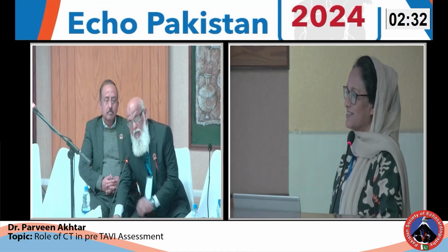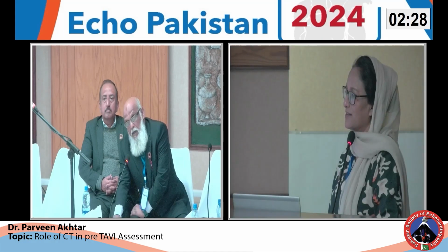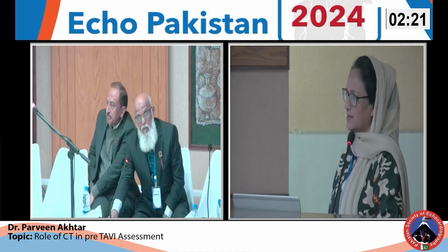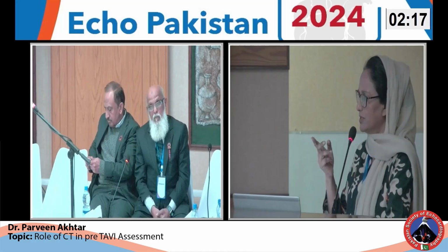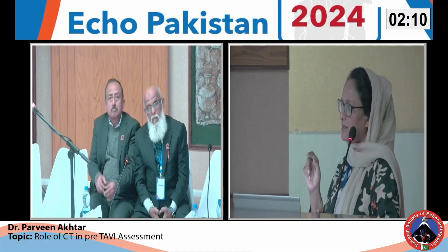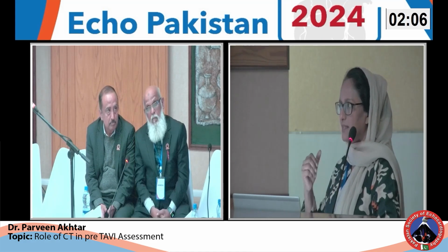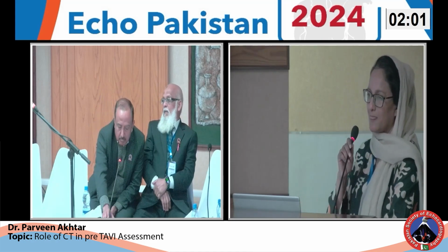No, I am not asking you that. I'm asking how often the interventional cardiologist refers you back after doing TAVI, for post-TAVI evaluation. As I told you, if there is a complication, like if they have suspicion of thickening of the leaflet or degeneration of the TAVI valve, then they refer to me. Otherwise, never.